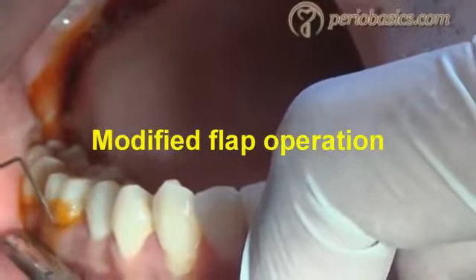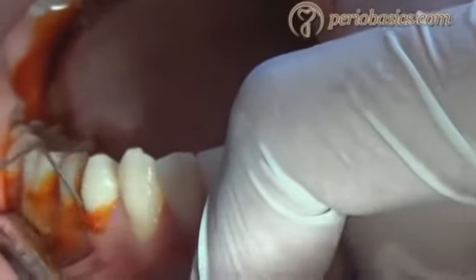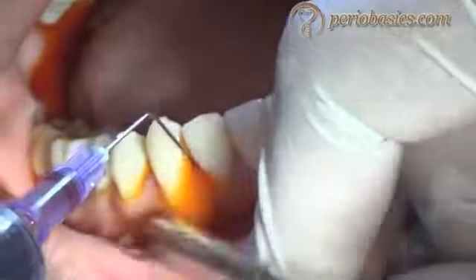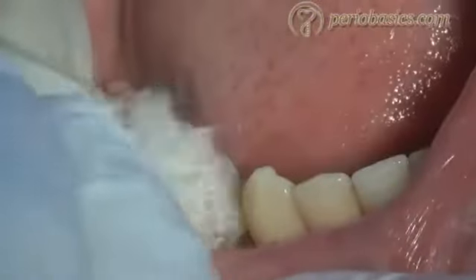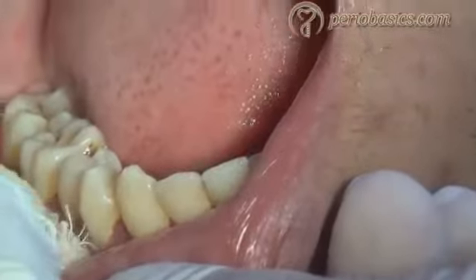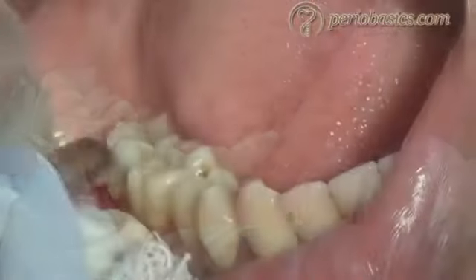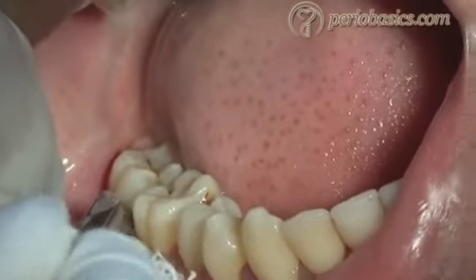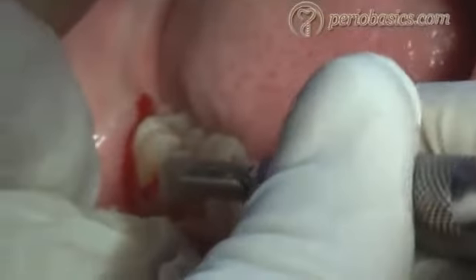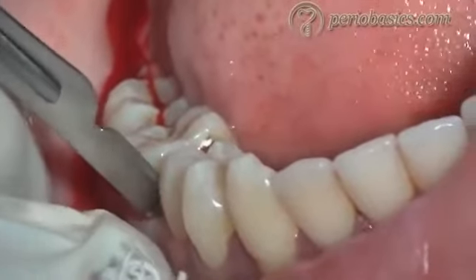So we have a patient here with chronic generalized periodontitis with moderate to deep pockets. First of all, we irrigate the area with antimicrobial solution, and then we isolate this area with the help of gauze. Then we start with the incision. In the posterior areas we use blade 12D, and we go from the sulcus till the bone, and in the anterior areas we can use a 15C blade.